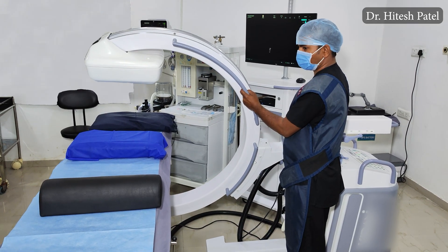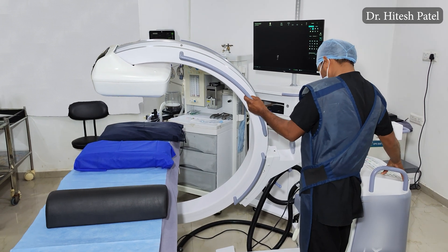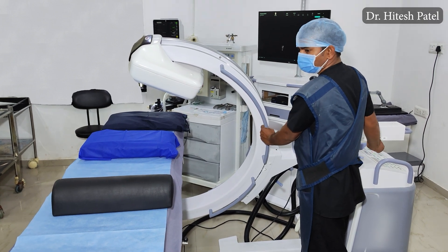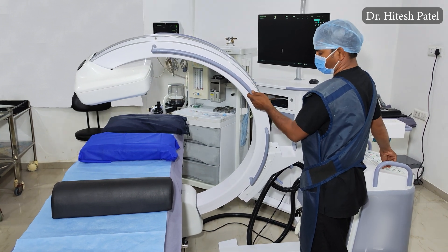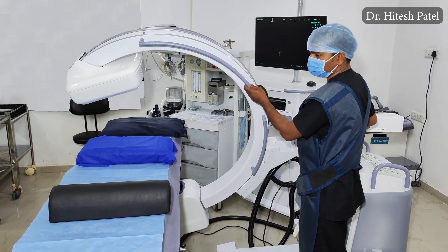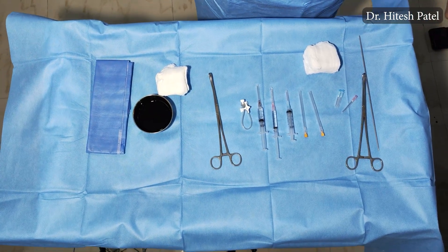Once the end plates are parallel, if we want to do the procedure on the right side of the patient, we tilt the C-arm to the right to open up the foramen. If we want to do the procedure on the left side, we do an oblique tilt to the left. Once we have opened the foramen, we can place local anesthetic there and insert our spinal needle to reach up to the epidural foramen, and we are ready for the lumbar transforaminal epidural procedure.